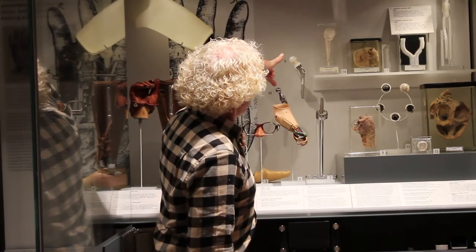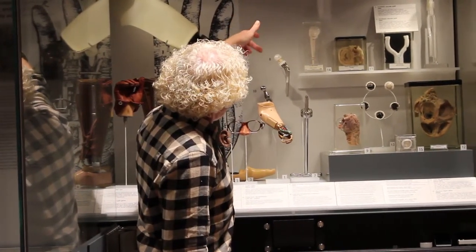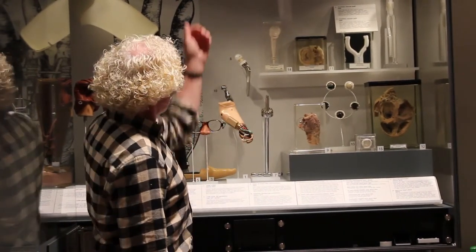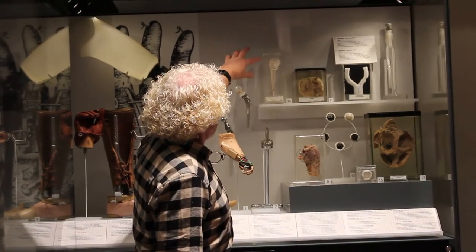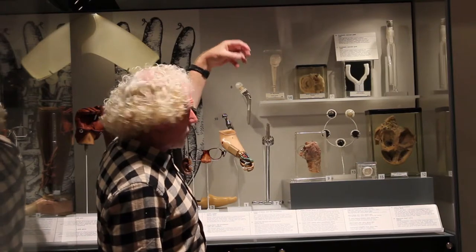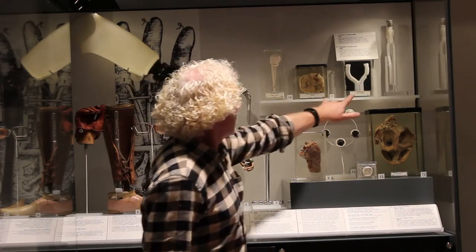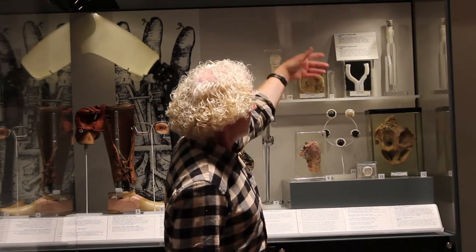The remainder of the case features internal prosthetics. Here are developments of a hip joint — this section extends down into the femur, and this plate would go into the hip itself. It has taken a long time to develop the materials to make successful joints. This early one is actually made of ivory — elephant ivory which has been carved — chosen because it was strong, substantial, and very smooth so it wouldn't attract a lot of bacterial growth. These ones here are vascular grafts, which would replace major vessels in the body damaged by aneurysm or injury.